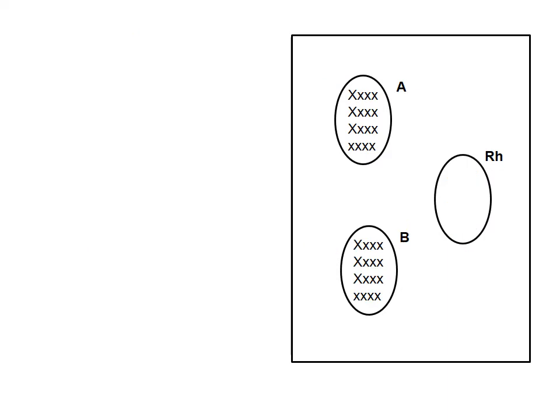Let's look at this one. So anti-A is here. It did react. Anti-B antibodies found theirs. It did react. The anti-D did not react.